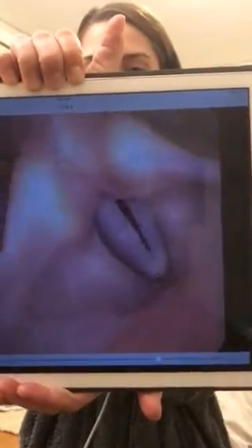So I'm going to go ahead and play that video clip that we just recorded first, and then I will go back in and explain what's going on. So here's the clip. Okay, so let me just find a good picture here.